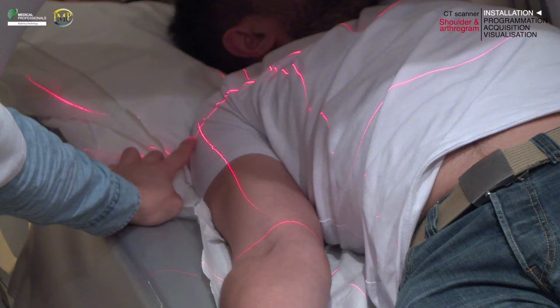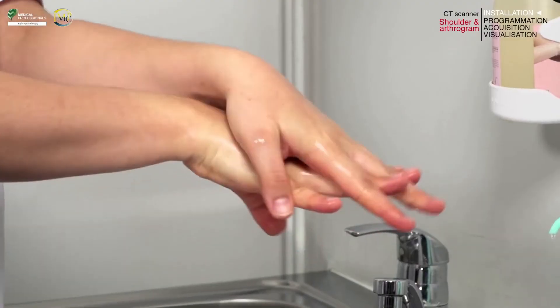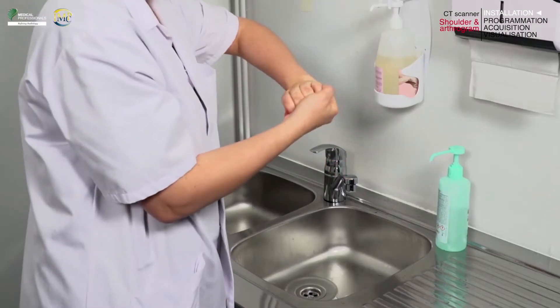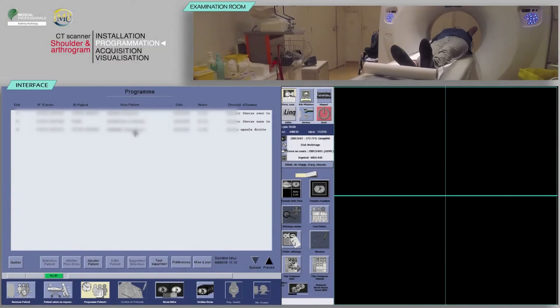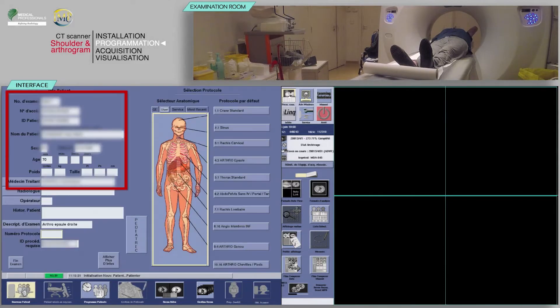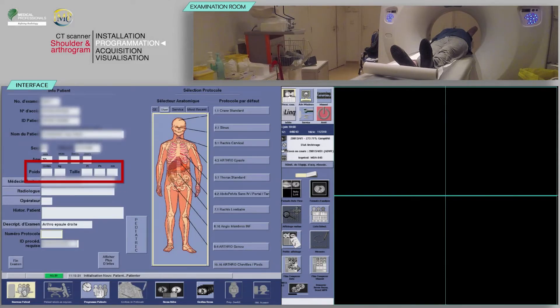Remember to close the doors of the examination room and perform proper hand hygiene such as a rub with an alcohol-based hand sanitizer. Select your patient from the worklist, then click on Patient Selection. Verify that the pre-filled information is correct and fill in the patient's weight and height. Finally, select the appropriate protocol.